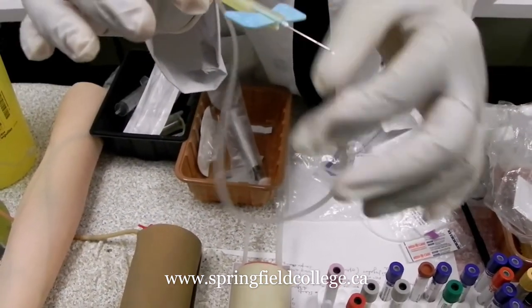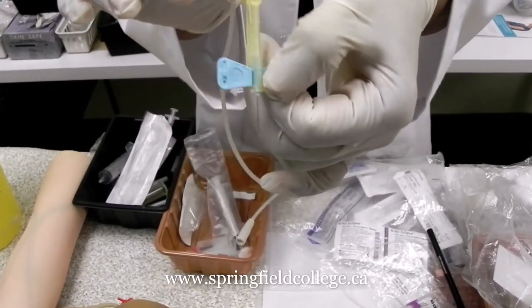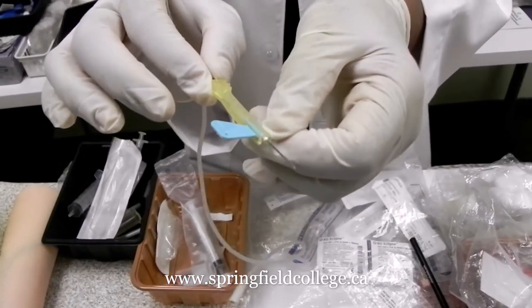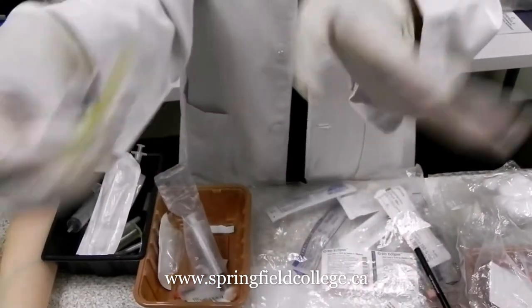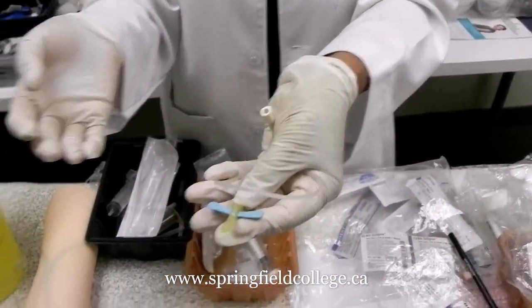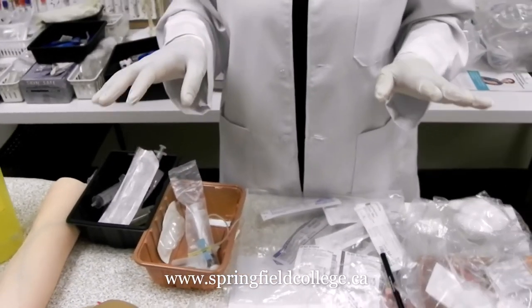Just to have a look at how the butterfly looks — this also has a safety feature. Once the work is completed, you can just flip it back and it is covered. So this you can discard in the sharp container.